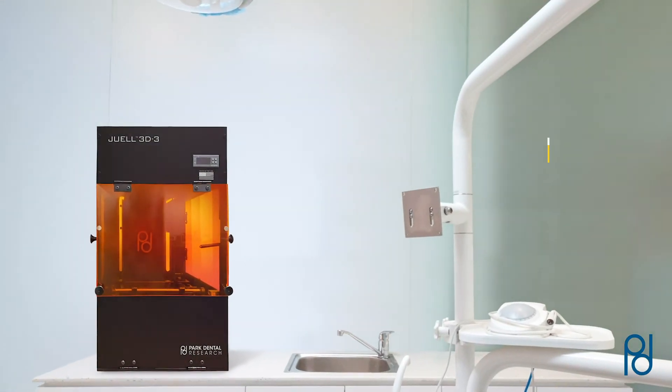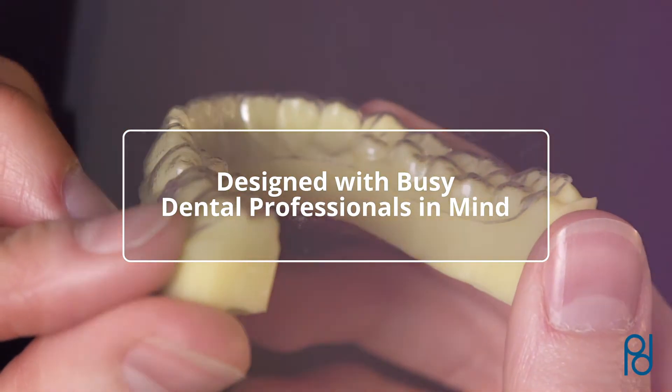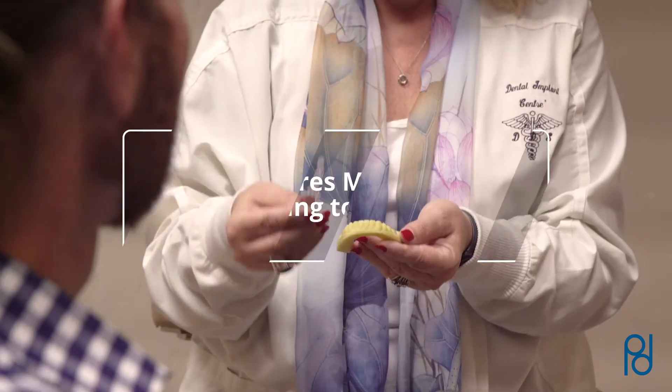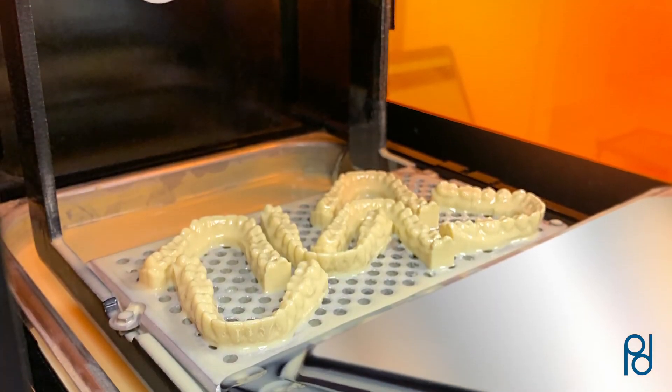In addition, JUELL 3D Flash OC software was designed with busy dental professionals in mind. The simple, intuitive interface requires minimal training to master, so you can spend your time on what matters most.